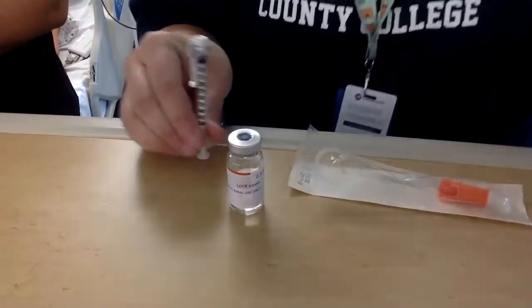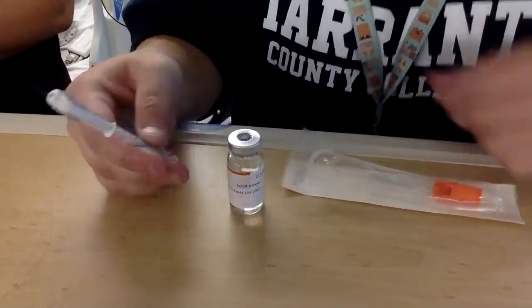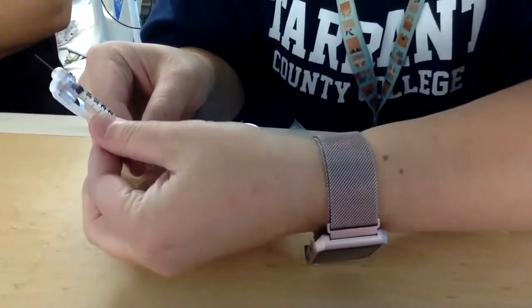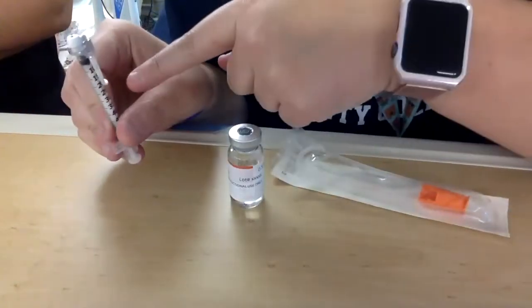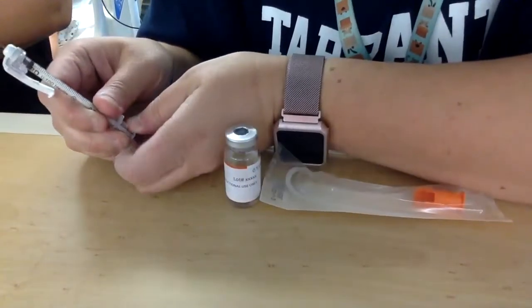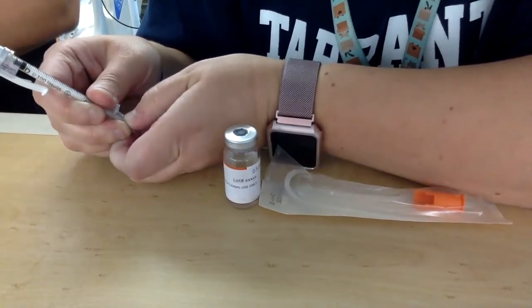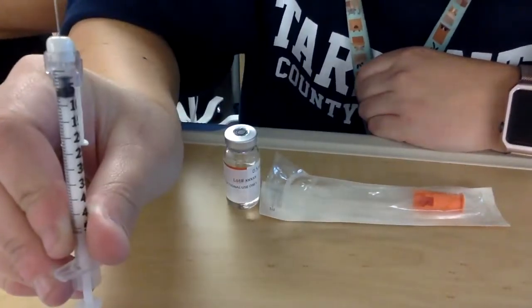So what I do, just like with everything else, you can see there are little numbers on this. And by the way, a lot of students don't know this: you can move this white thing over to the side and twist it so that you can better see your numbers there. So I'm going to pull back just like I would with an IV injection, and I'm going to pull back for 2 units. And some nurse is going to need to check my insulin after.